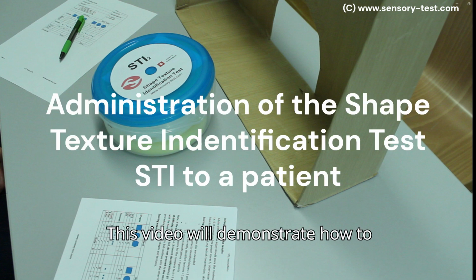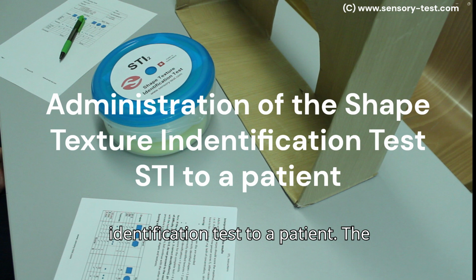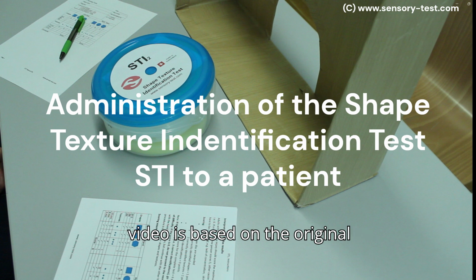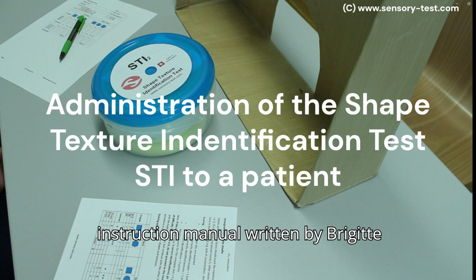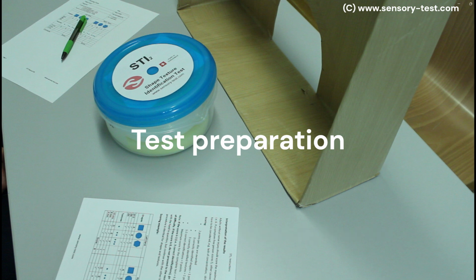This video will demonstrate how to administer the shape texture identification test to a patient. The video is based on the original instruction manual written by Brigitte Rosen. Before starting the test, please read the instructions carefully.